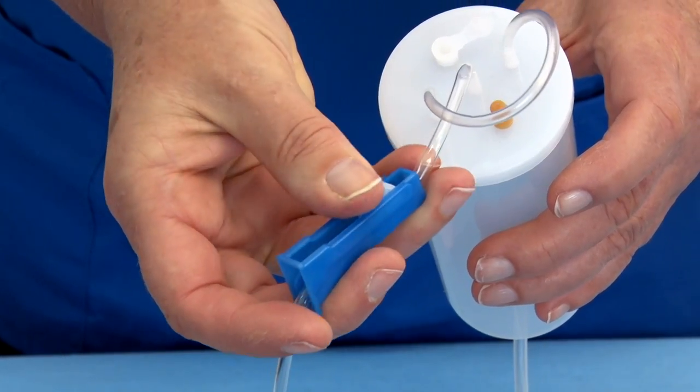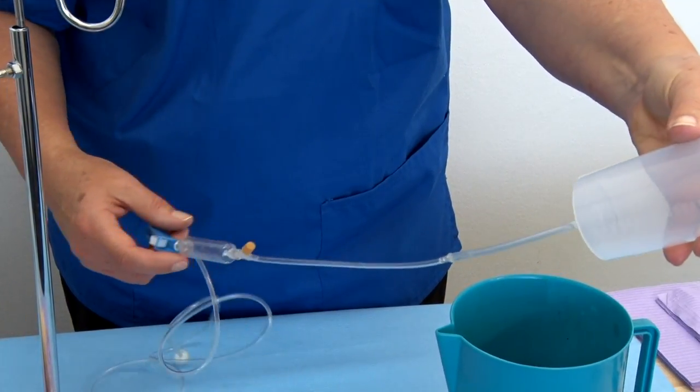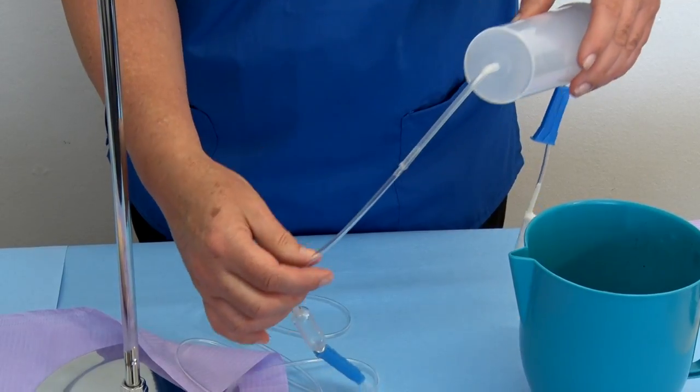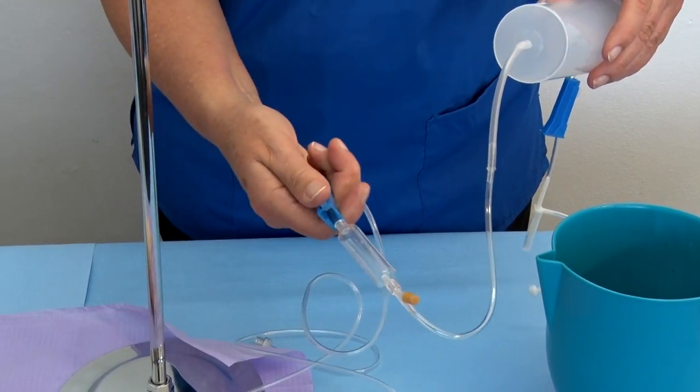Step 9: For now, close this inflow roller clamp. The container has an outflow tube connected at the bottom. We will be referring exclusively to the outflow tube in the balance of the instructions. Close the outflow tube roller clamp.